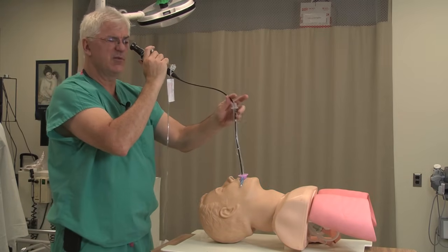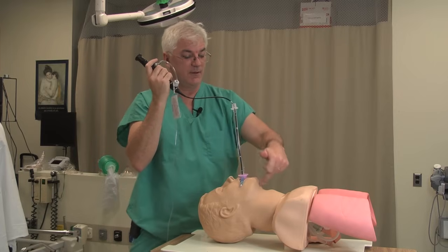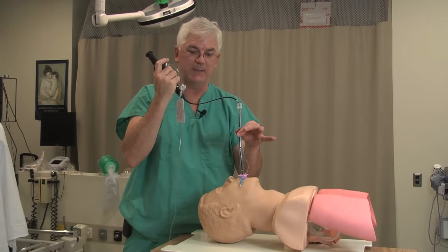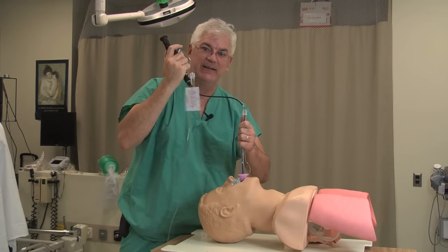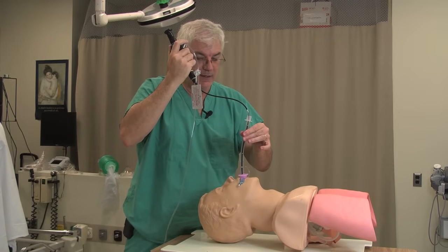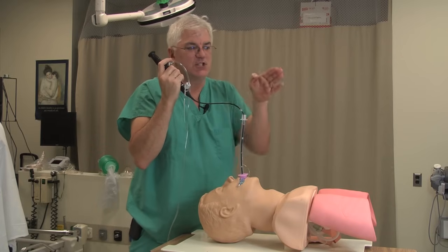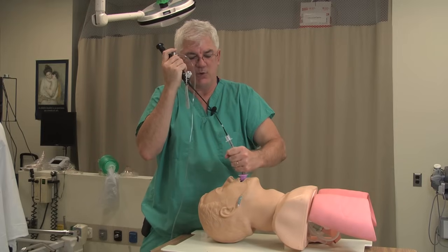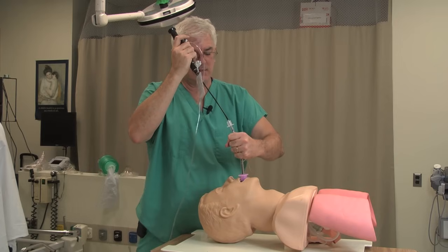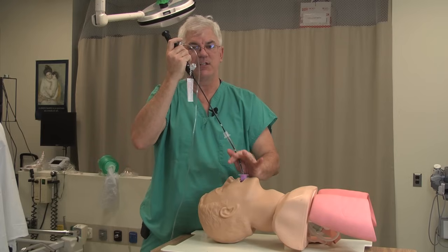Once I see the cords and get through them, now you've got to get the endotracheal tube in. It's like the Seldinger technique — you have the fiber optic in the trachea, but now you have to get the tube in. One of the biggest headaches is you slide down and it gets stuck. There's a temptation to just ram the thing through, but don't do that. If you get stuck, that means one edge of the endotracheal tube is bouncing against one of the cords. Just turn it 90 degrees and see if it goes more easily — just keep turning until the thing eventually goes in.